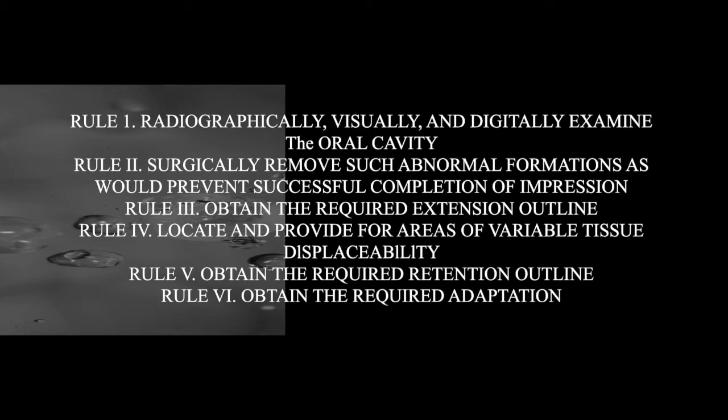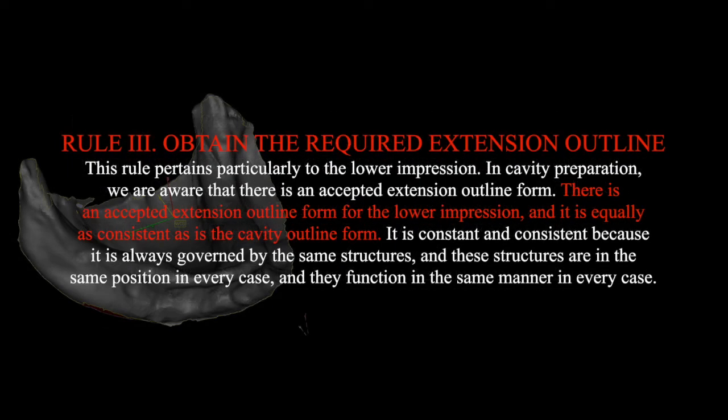As I mentioned, let's take a look at Rule 3 in more detail, in depth. This rule pertains particularly to the lower impression. In cavity preparation, we are all aware there is an acceptable extension outline form.